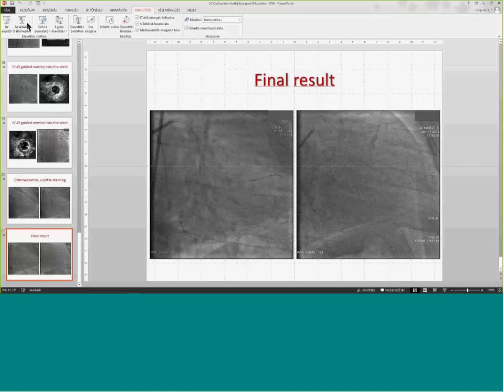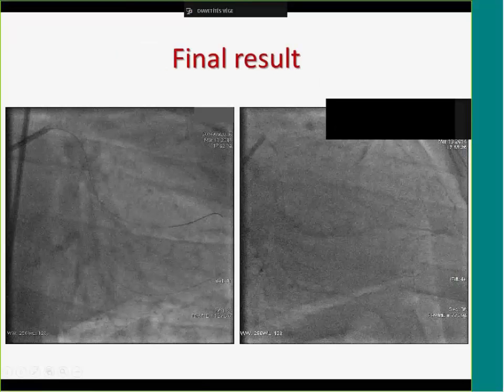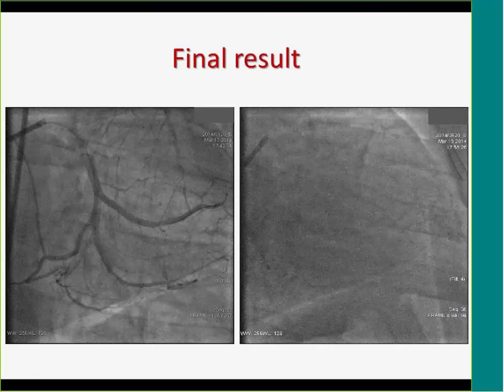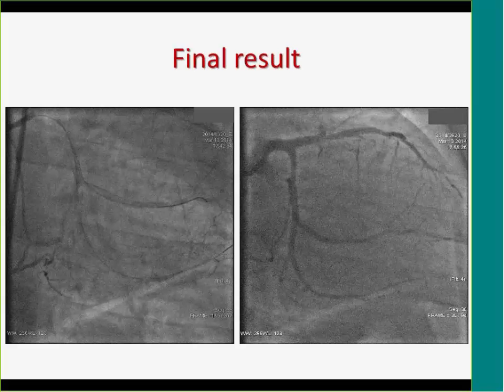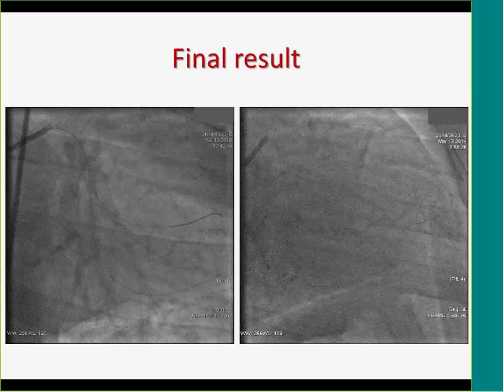Again, a very important and a real good question. Actually, it was very difficult, especially crossing with the microcatheter of the proximal cap, and to advance the microcatheter in the stent. It was very difficult.